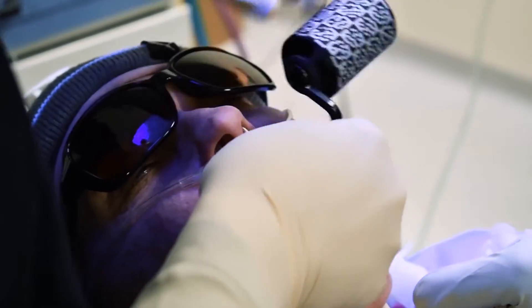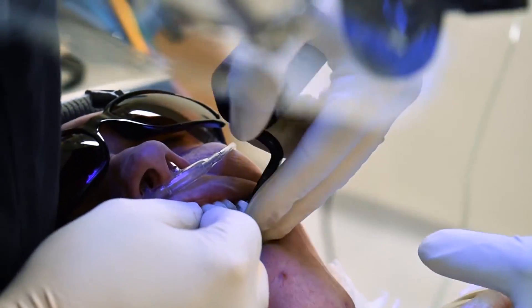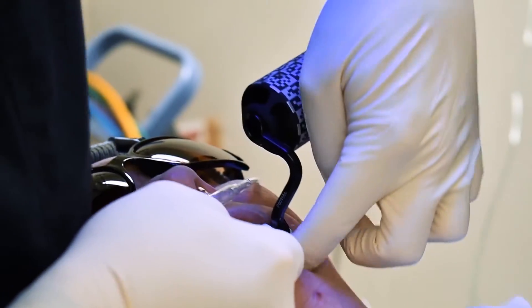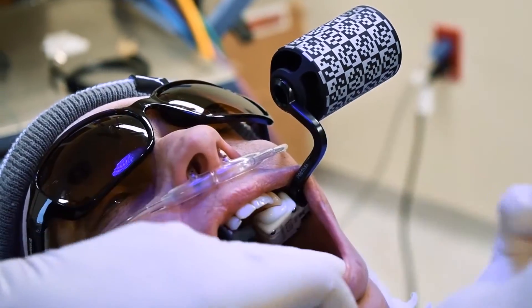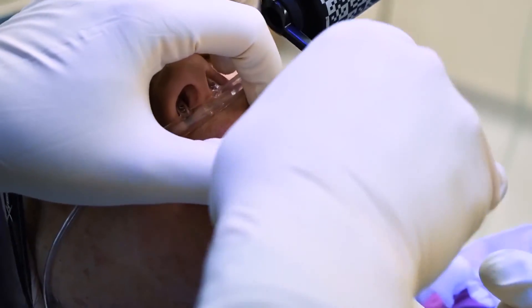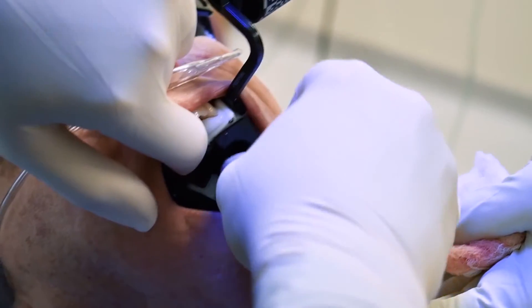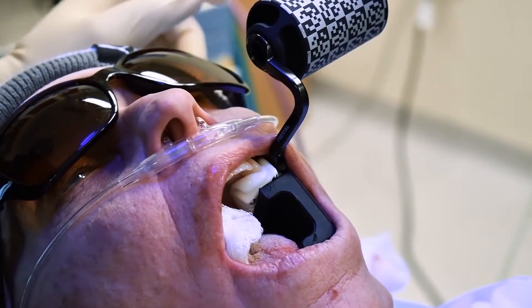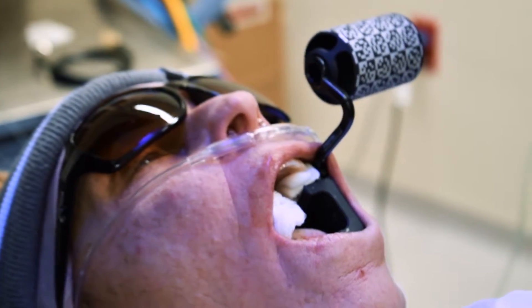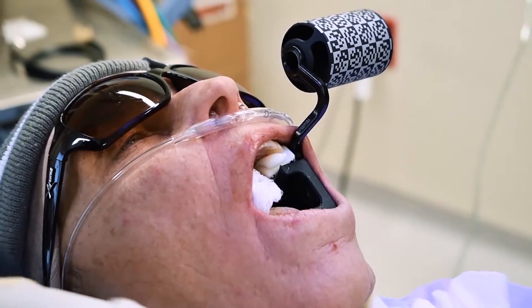This is where it's real tricky. If you can come up with a different light — there we go. I just had to find the right way that that actually seated in position. You'll notice that one of the wings is cut off the bite block, so that I can place this in between, keep the clip seated, and have her open enough that I can actually work. Her airway is just a little touching, so you work with that.